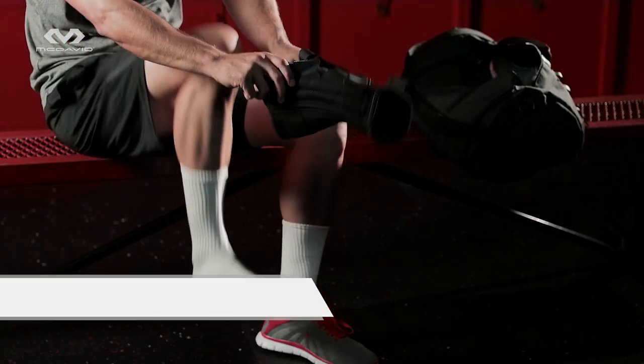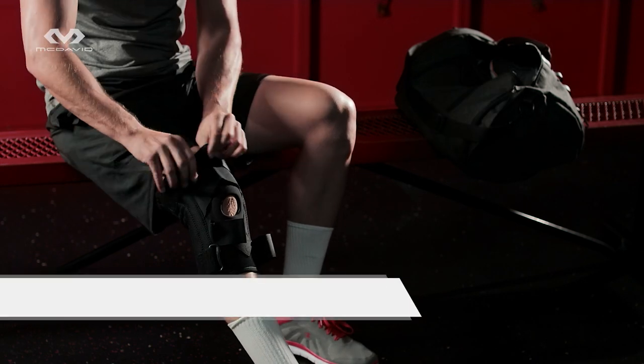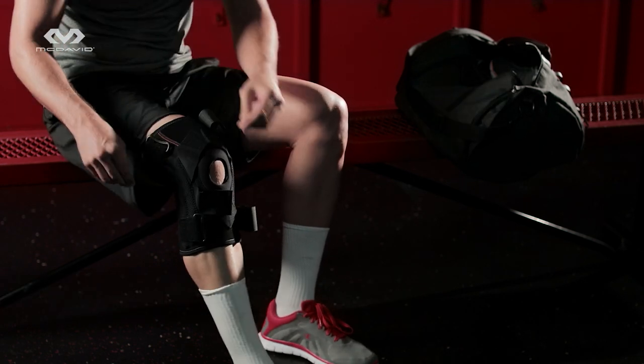Okay, let's gear up. Wearing the 425 is designed to be easy. Slip the entire brace over your foot, up the leg, and position the kneecap into the patella opening.